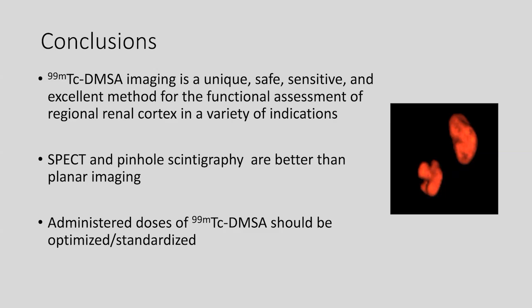So in the future, not only because of improved imaging technology, but also reconstruction technology, instrumentation and software, perhaps the imaging will be optimized and the dose may be reduced significantly, even though we already are reducing the dose. So in summary, excellent method, very unique.